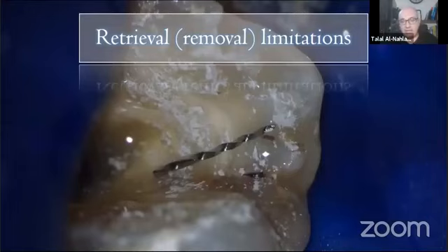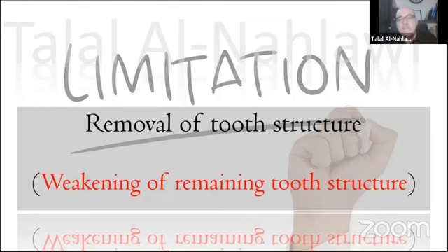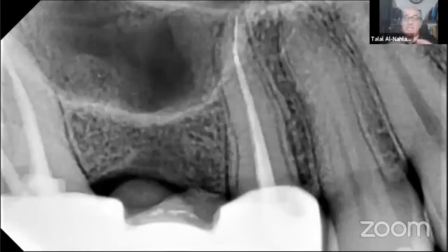is still in place. Not to speak from one side, we also have to speak about the limitations of retrieval. It is not that retrieval is the best case scenario and the bypass is the worst case scenario, or the opposite. We have limitations for each treatment modality. One of the biggest major complications is the weakening of tooth structure and sometimes making a stripping perforation, especially if we are not trained well.